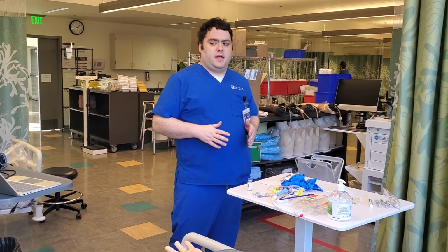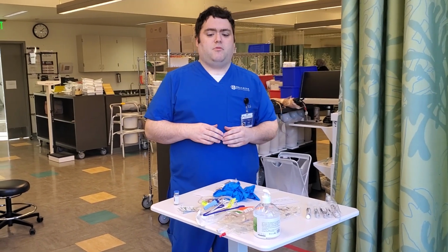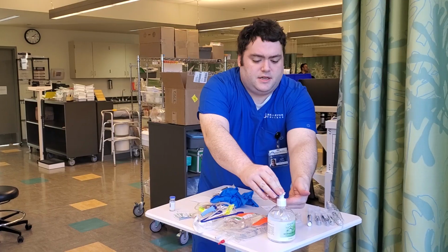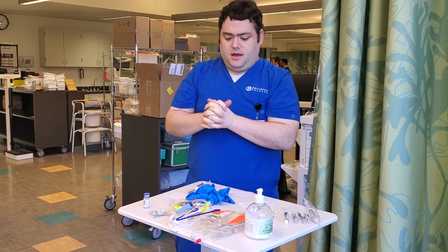So now we're going to go ahead and set up. Say we're in the medication room right now and I've gathered everything I need. I'm going to first perform some hand hygiene, and we have all of the meds here.